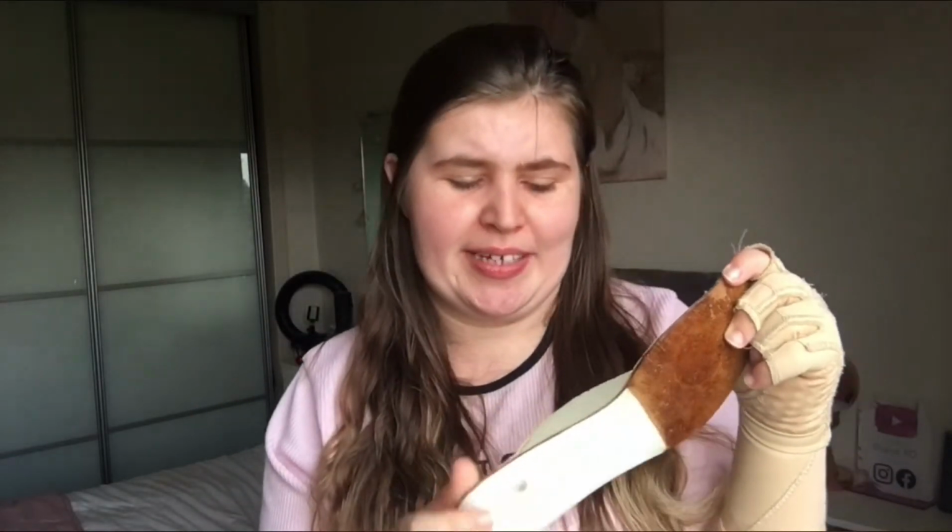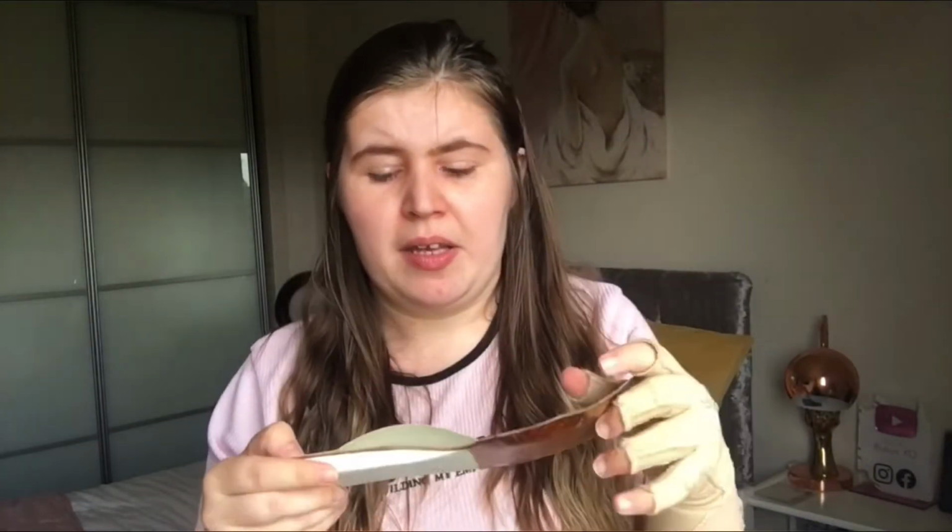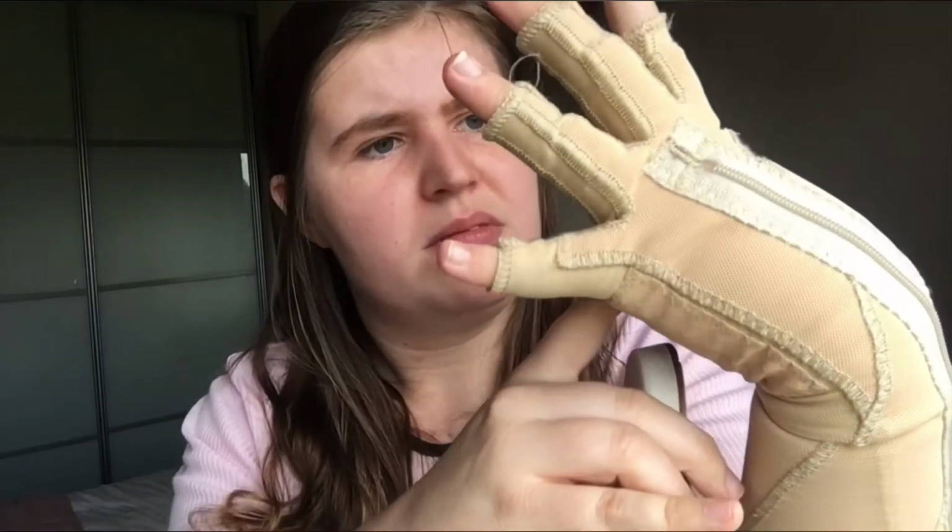Next thing is this foot splint. That's what I would call it. Don't know what you guys call it. I get these checked out. The reason why I get them checked or renewed, like get a new pair every 1 or 2 years, I think it's 2 years, with my hand strap as well, is because one, this can wear and tear, and two, again, this can wear and tear. As you can see, all the threads there are already wearing.